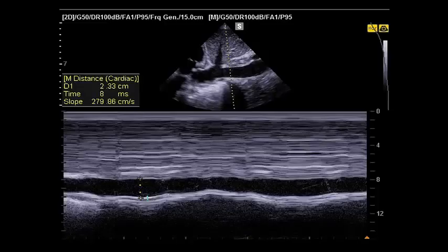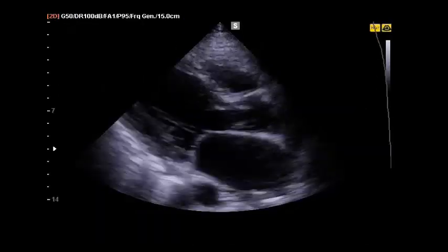We started the advanced critical care ultrasound. The patient didn't have any echo in this small hospital. We found this type of inferior vena cava, which is dilated and non-collapsing. So in this situation, you need to think about a cardiac or obstructive cause of this dyspnea. It could be cardiac dyspnea or it could be pulmonary embolism, an obstructive cause of dyspnea. You will need to go to the heart.